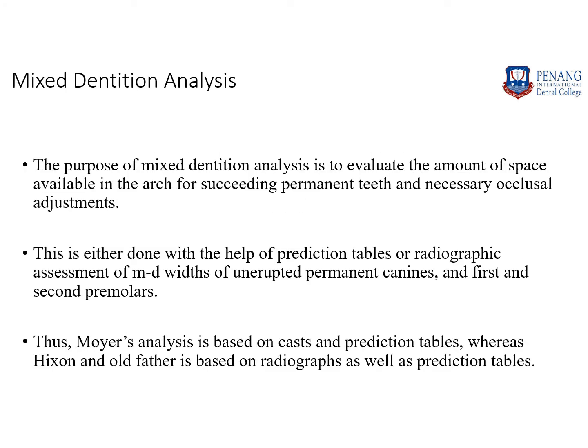Okay, we've now reached the second leg of model analysis, which is the mixed dentition analysis. Basically, what is the purpose of performing a mixed dentition analysis? Here it will help you in evaluating the amount of space available in the arch for the permanent teeth to fit in.